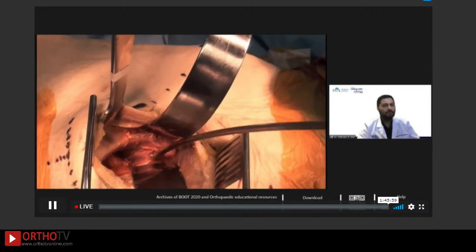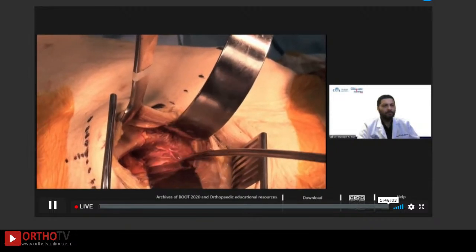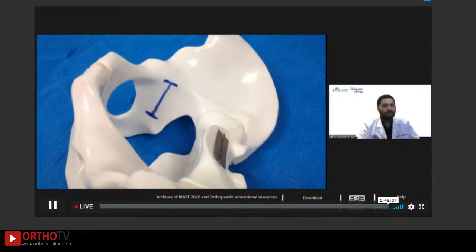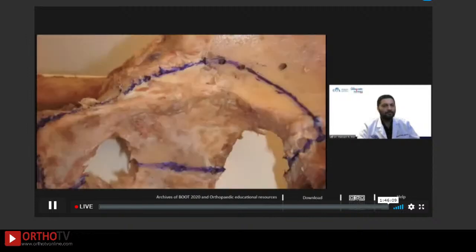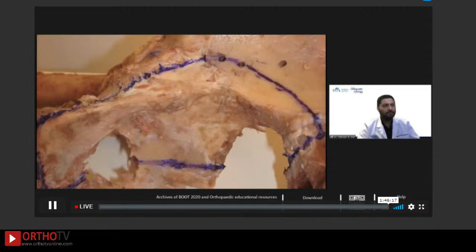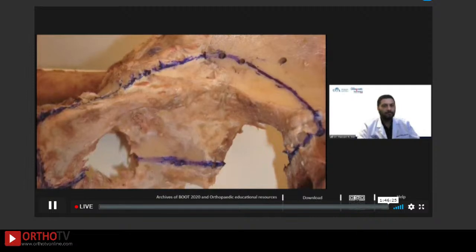We now have exposure of approximately 2 centimeters above the pelvic brim and 5 centimeters below the pelvic brim. A sharp Hohmann over the anterior acetabular wall and a malleable retractor posteriorly may help in widening the exposure. In our cadaver study, we performed the Stoppa approach on 10 specimens and then used a drill to mark the boundaries of exposure. We then stripped off all of the tissues and calculated the viewable surface areas and boundaries in relation to the bony landmarks. Please see the article for details of our findings.